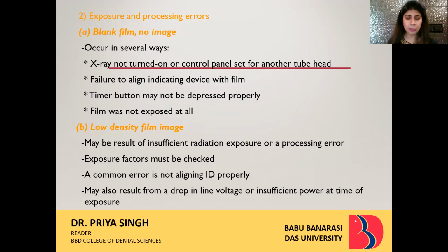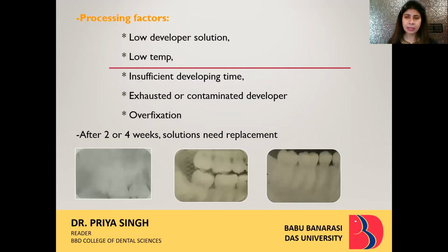It may also result from a drop in line voltage or insufficient power at the time of exposure. Now this is beyond our reach, and if it has happened, you should be able to identify the artifact and even convey to the patient that this was beyond your control. Then processing factors: at times the solution itself is not adequate or it has some depletion. So that should also be checked before actually processing a radiograph.